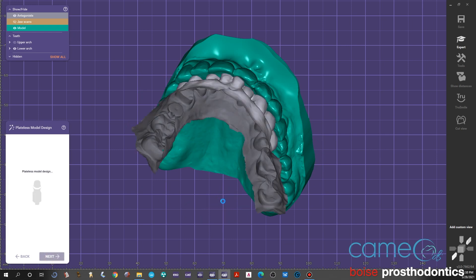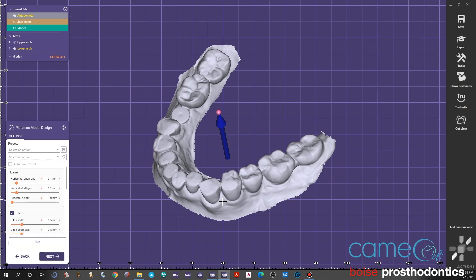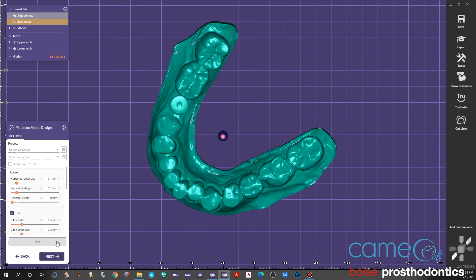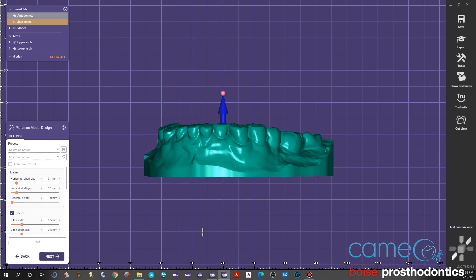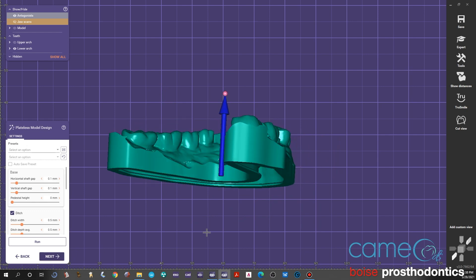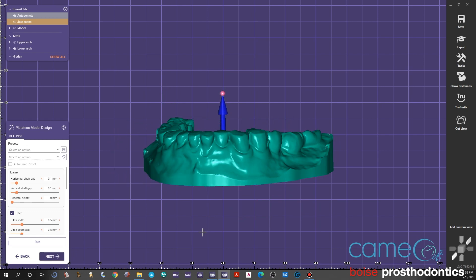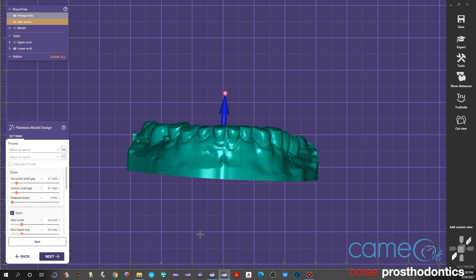Now we will hit next and we do the same thing with the mandibular model. Set the view, hit run, it'll calculate it, and you can see where it built that base down. Looks pretty good, we'll hit next.